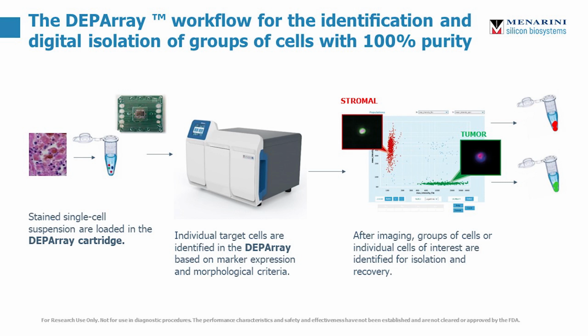For example, and you'll see this a lot in the chat today, is stromal cells, so healthier baseline cells, compared to our tumor cells. That gives us an internal control and compares it against the diseased tissue. And we can isolate those cells either as single cells or as pools of cells, depending on what kind of analysis we want to run downstream.